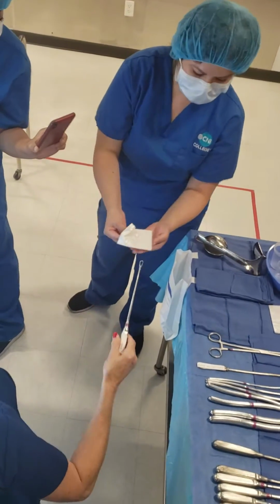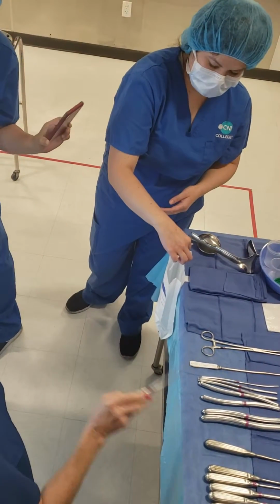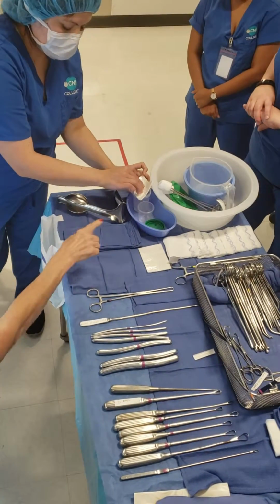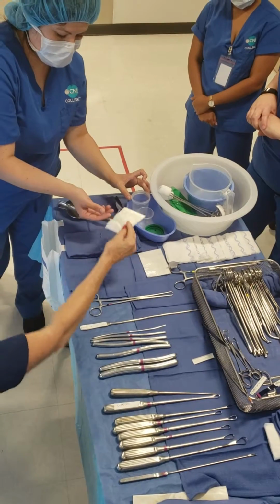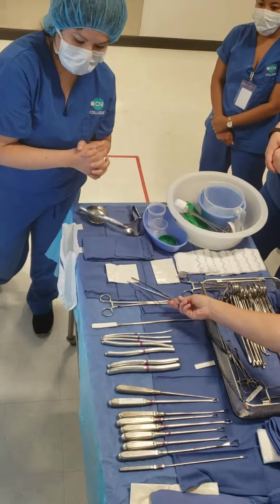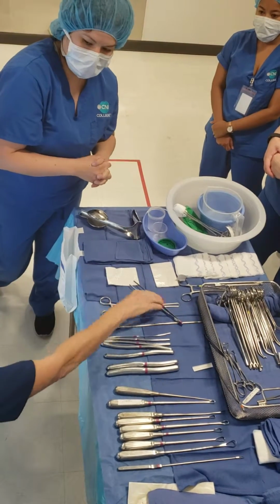Okay, let's have that as our specimen, and then the scrub tech. Does it go in a cup? Cover a specimen. Mm-hmm. You don't put it in there with that. Don't do that. So you're gonna lay it down, but you're gonna say, what do you wanna call the specimen? And then I'm gonna tell you it's endometrial tissue.